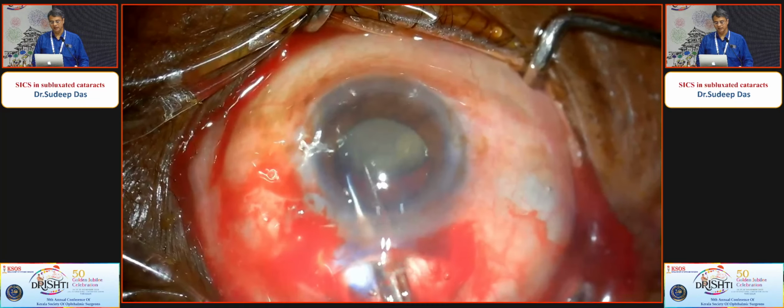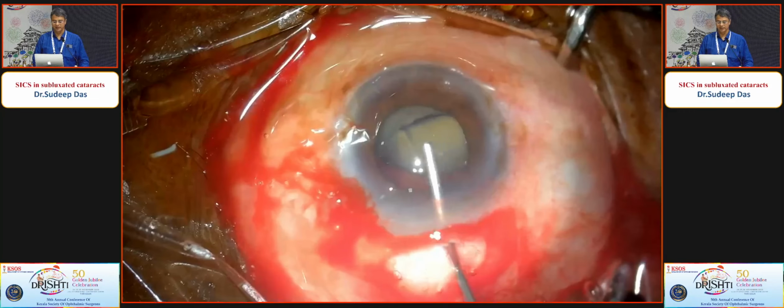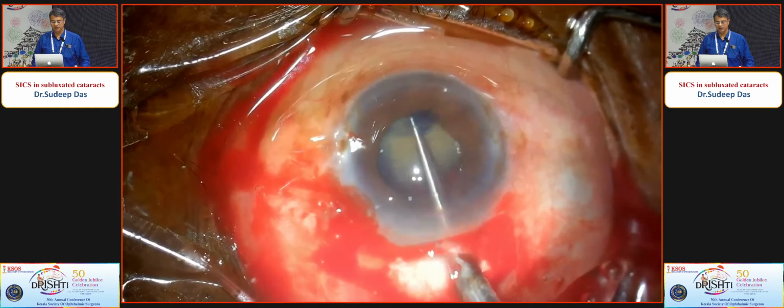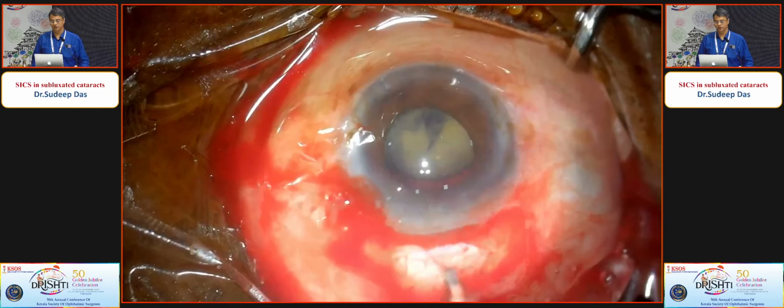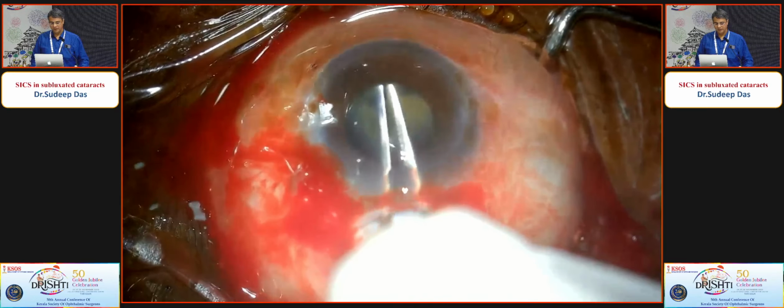And then, here I actually tore the lower part of the capsule, but sometimes I support the bag, the capsule, with my left hand and use micro scissors with the other hand and cut it off. So the whole thing is there.